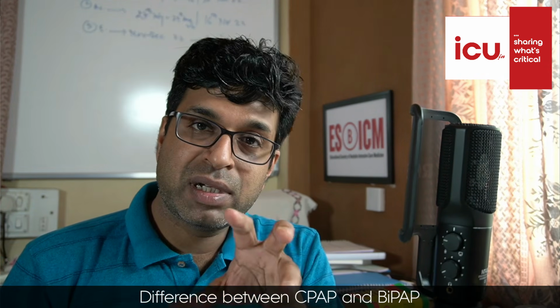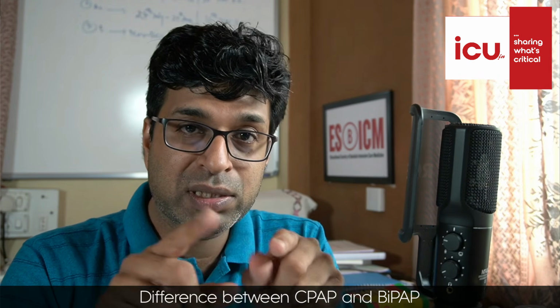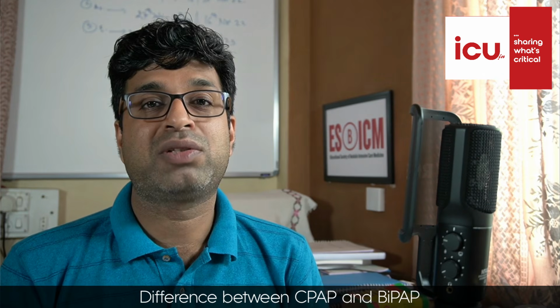Now we are coming to the third part, how you will adjust the settings. If your blood gas says that the patient is having PO2 of 50, pH of 7.4 and PCO2 of 35, so PCO2 is normal, your pH is normal, the only thing is hypoxemia. So what you need to do is increase the oxygenation. How will you increase the oxygenation? You will increase the EPAP so that your alveoli don't collapse during the expiratory phase. Alveoli should remain open and it will increase the oxygenation.